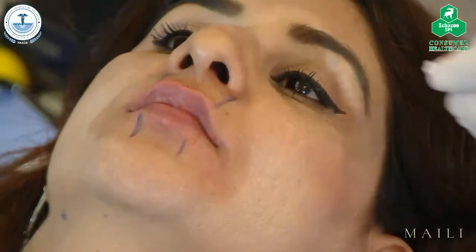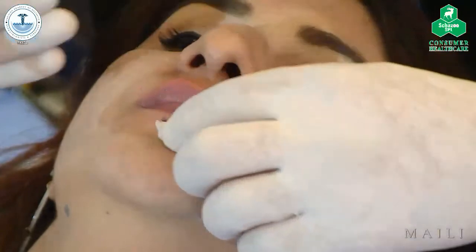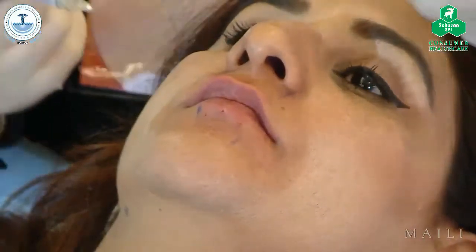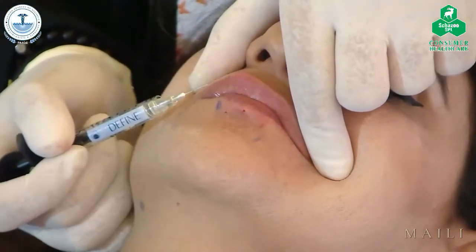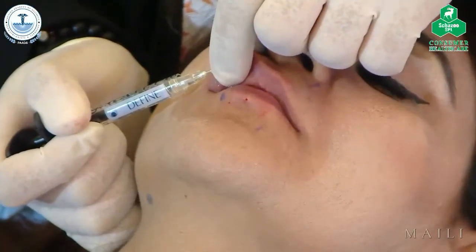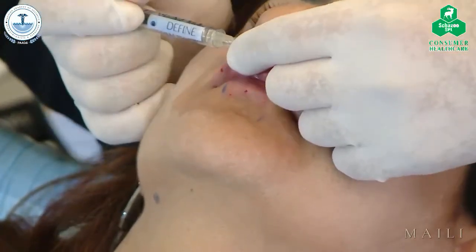Now we've done that, I'm going to move to my lip border. I think one of the good things about Maili Define is the lifting capacity that it gives. You don't need a lot, and it's very, very soft. I'll start giving the vermilion border just a bit of definition. Now I'm going to give less here, very little. I hold the needle between my fingers. I'm going to start giving more.